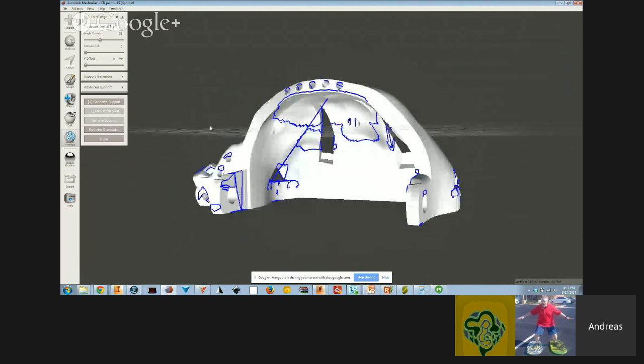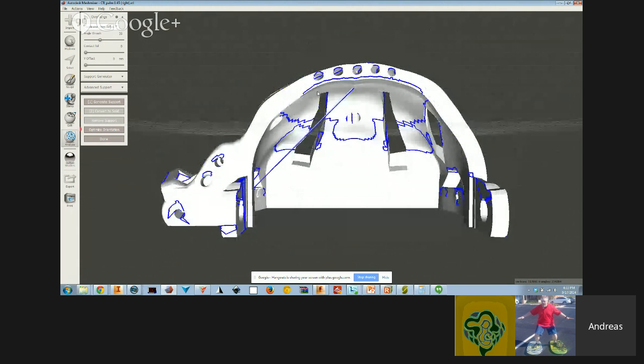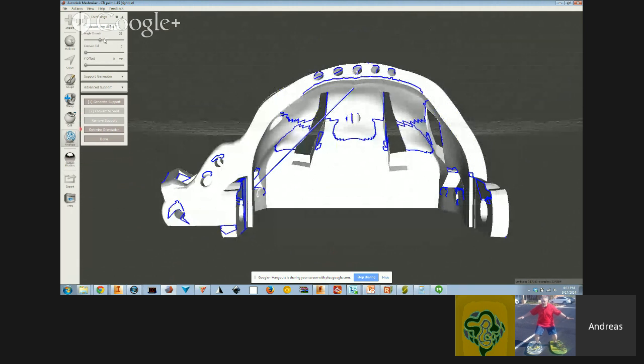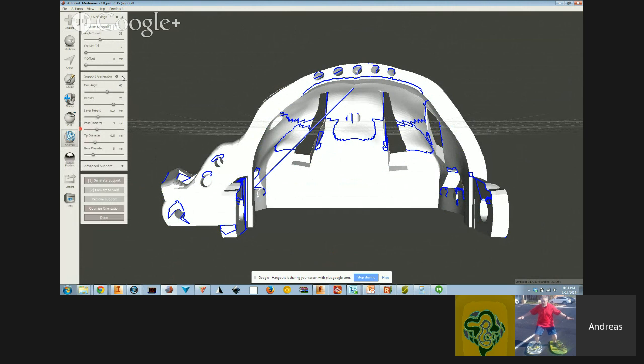Is everything looking correct? The shader doesn't look quite the same as on my computer, but basically, what I see on my computer is the overhang area is highlighted in red, and threshold. So as I increase this angle threshold, you'll see that the blue boundary, or the redness if you have red on your computer, will increase. So I'll go back to 35. Okay. Some of these other things, I won't get into every little detail here. Let me go back to the defaults, 3mm defaults, and just see what happens. We'll take a look at that.